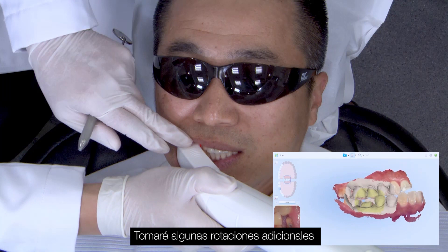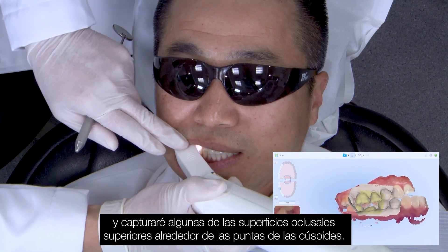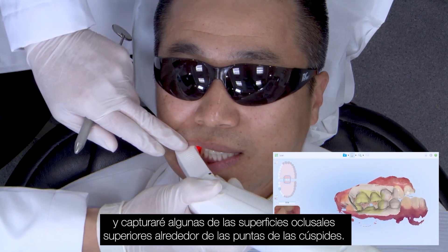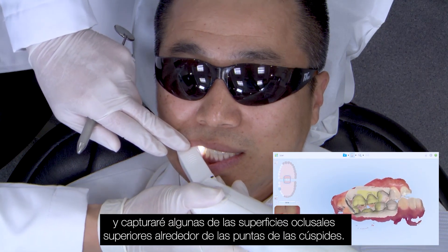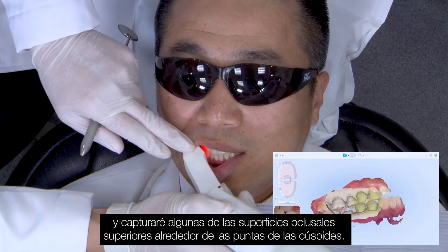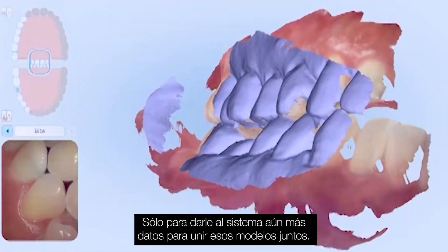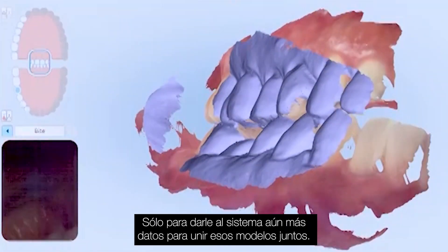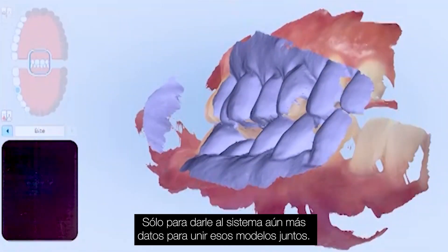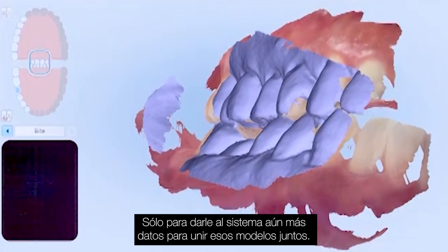I'll take some additional rotations — I want to capture some of the upper occlusal surfaces around those cusp tips, just to give the system even more data points to lock those models together.